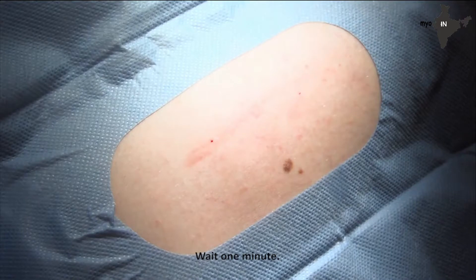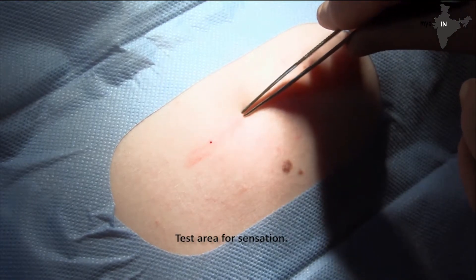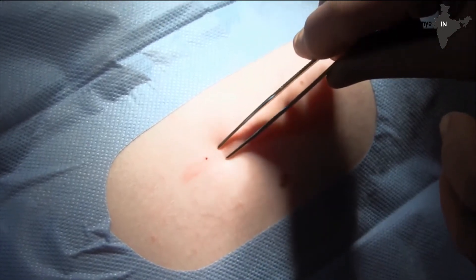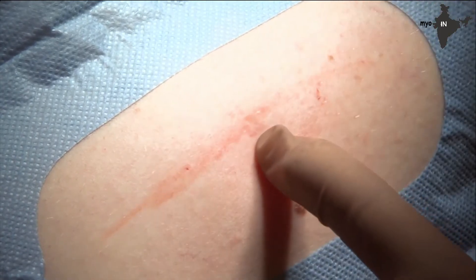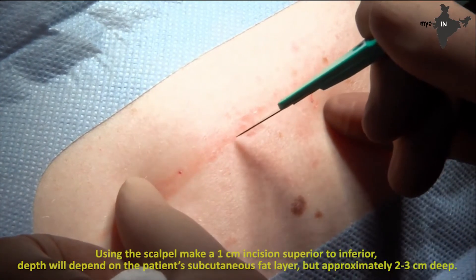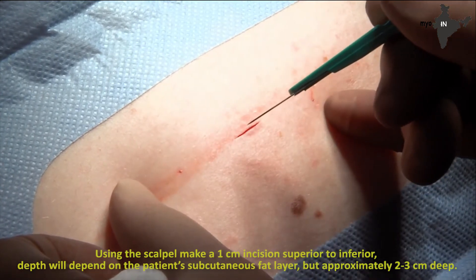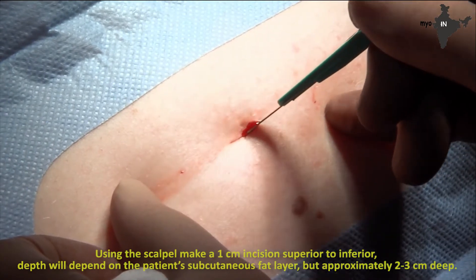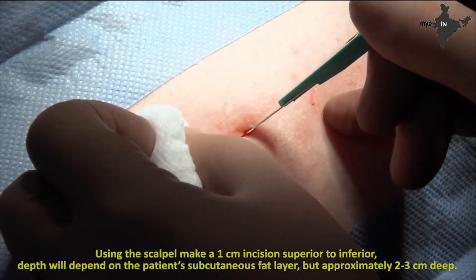Wait one minute. Test the area for sensation. Using scalpel number 11, make a 1 cm incision superior to inferior. Depth will depend on the patient's subcutaneous fat layer, but approximately 2 to 3 cm deep.